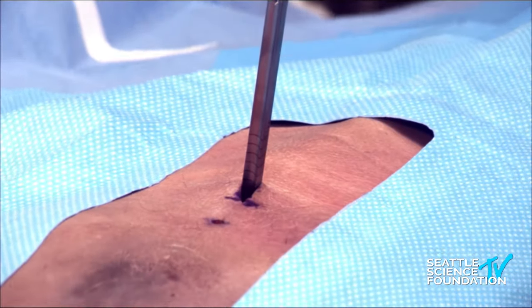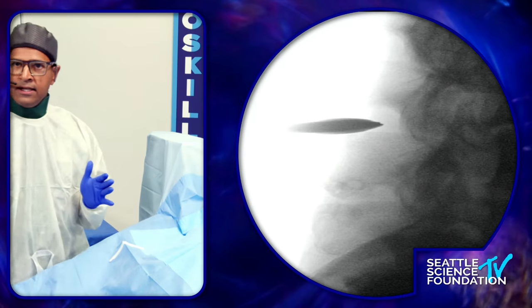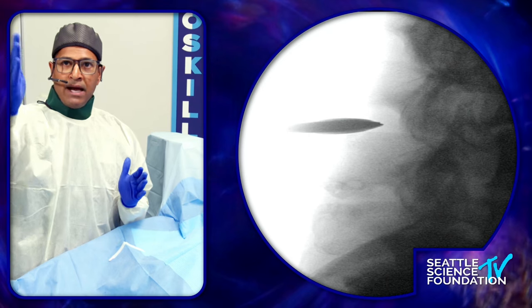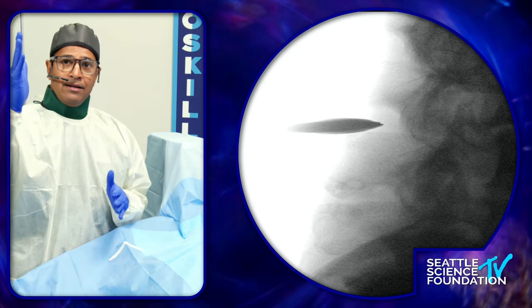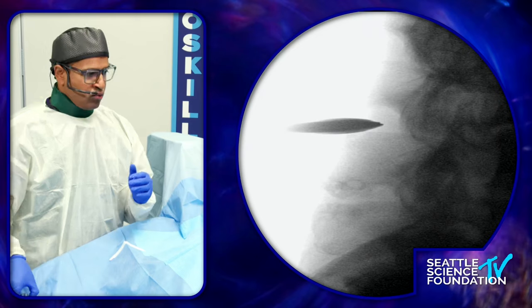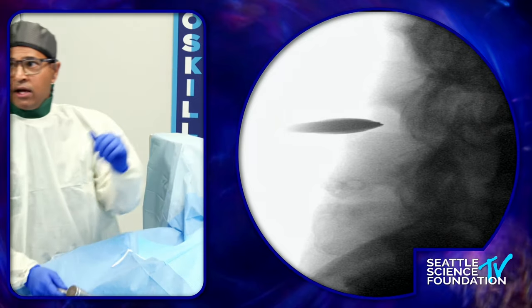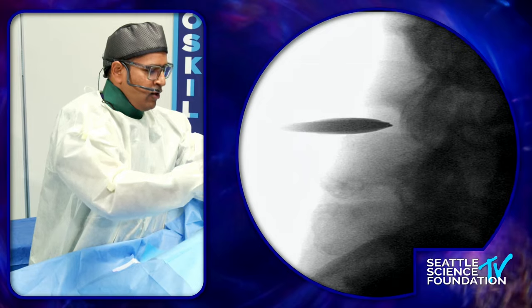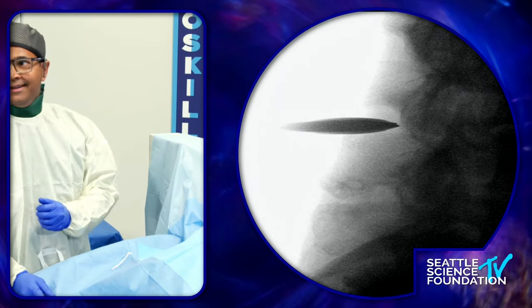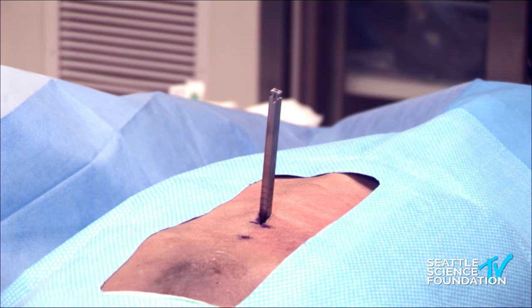For a relatively normal BMI patient, 30 millimeters is usually the average before we get purchase. If you're ever concerned you're going too deep, always take a lateral shot. You can see I'm in the interspinous space now. There's something called the spinal laminar line — that is the shadow of the lamina — and that is the line to never cross. That's the river Styx. With every instrument from here on out, we take it to that spinal laminar line. The only thing you can do to screw up this procedure is go too far into the spinal canal — do not do that.